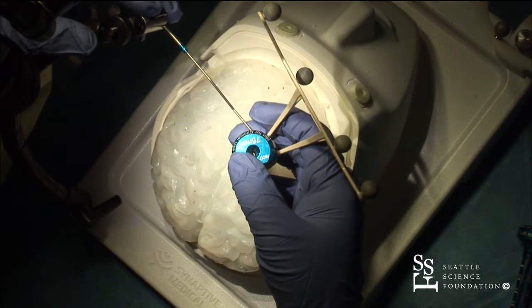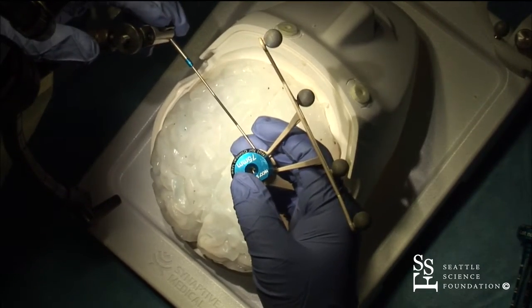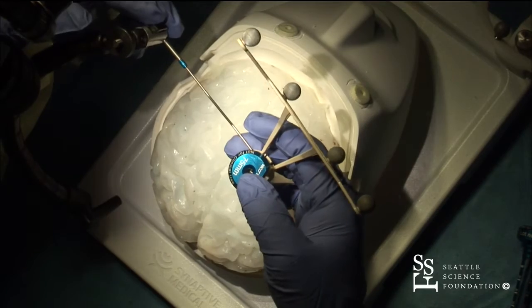It can be a little bit loose because, as I mentioned earlier, you're going to want to be able to toggle the tube, especially if you're doing a large lesion. So we have our pre-planned trajectory, have everything all set up, ready to go.